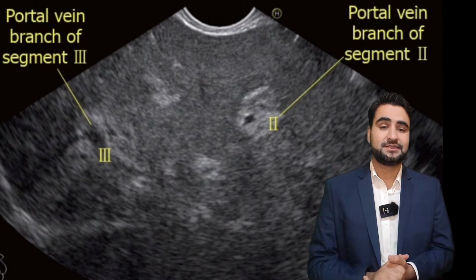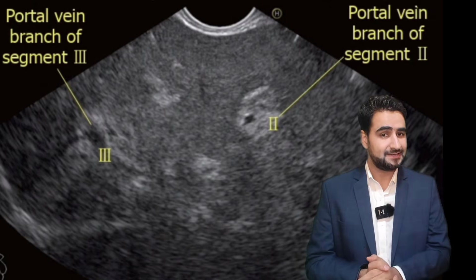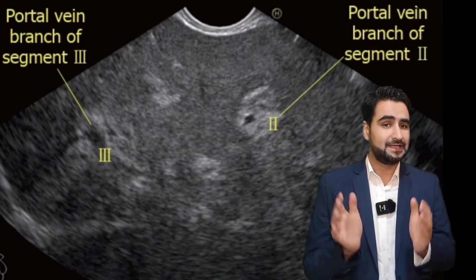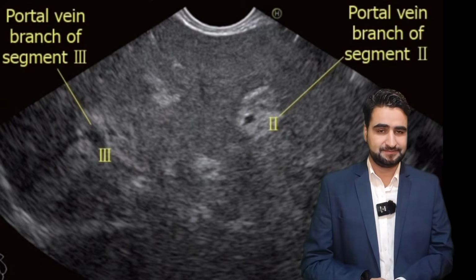This image is very important for EUS-guided liver biopsy or targeting portal venous sampling. Recognizing these two branches early helps orient you to the left lobe anatomy and is essential for further navigation.